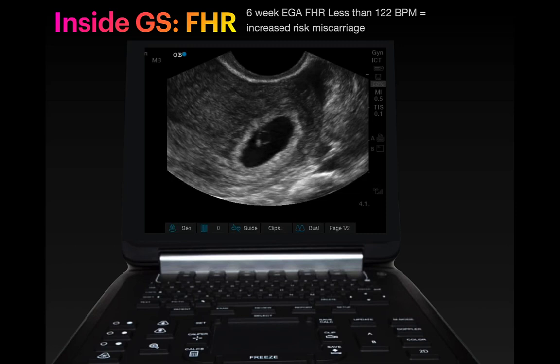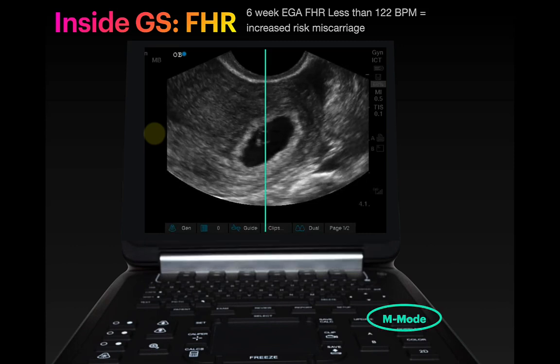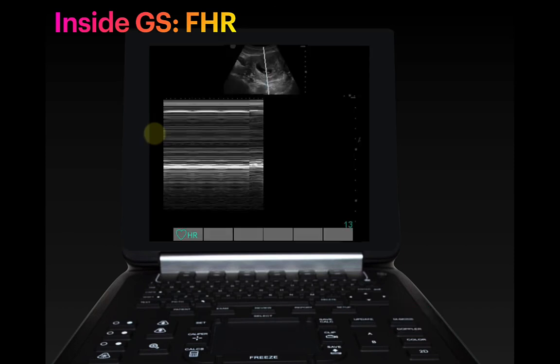If you look at this picture right here, what we're seeing is at the top, there's uterus, and here's a nice gestational sac. Here's a cute little yolk sac and a cute little fetal pole. And if you look at it really carefully, you can see the two black and white pixels that keep flipping on and off. So that is the heartbeat right there. The challenge with this is with your M mode button down here, getting this traced line on here and getting it right over these teeny tiny little pixels, hitting M mode again and getting a tracing that looks like this.